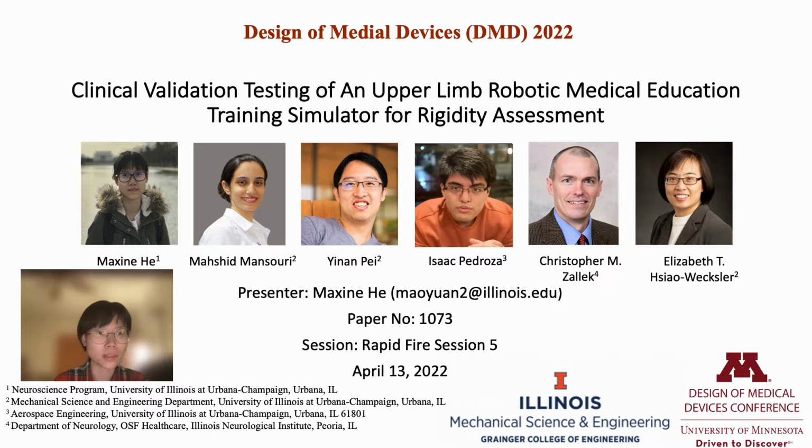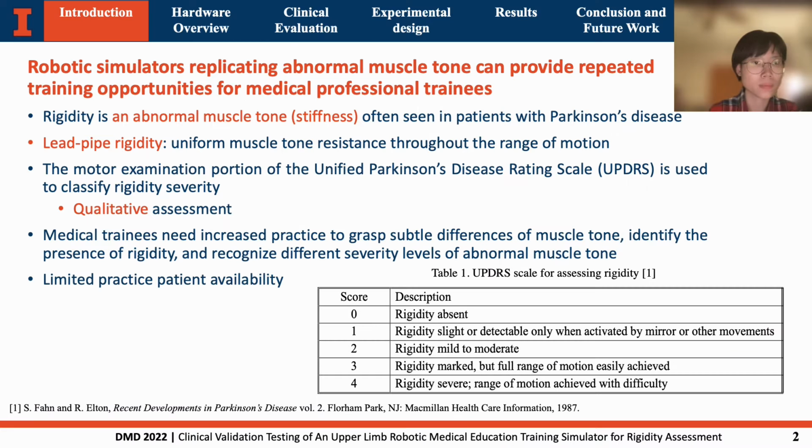Today I'm going to present our work on the clinical validation testing of an upper limb robotic medical education training simulator for rigidity assessment, and I would like to thank all co-authors here.